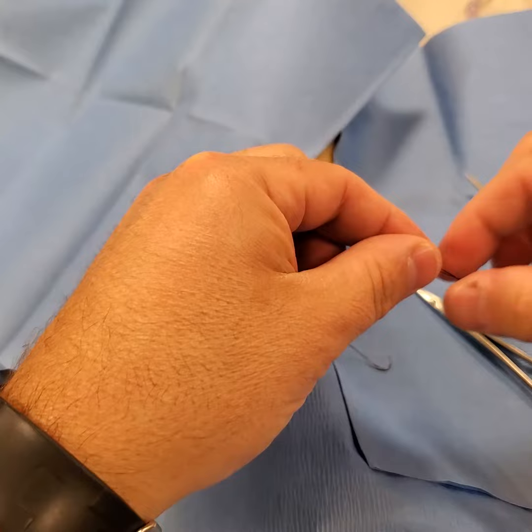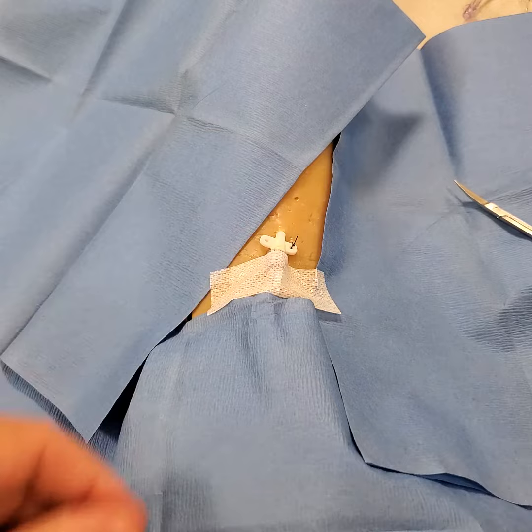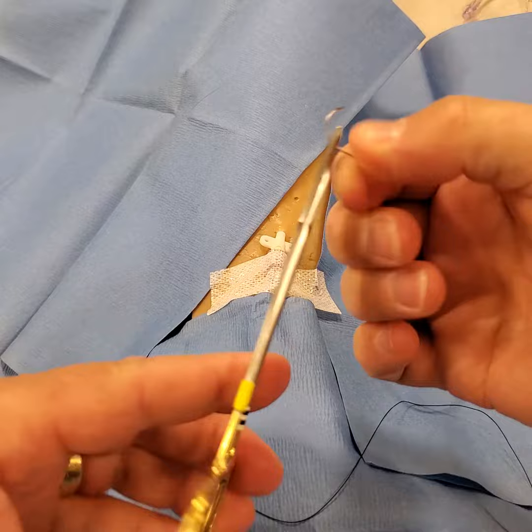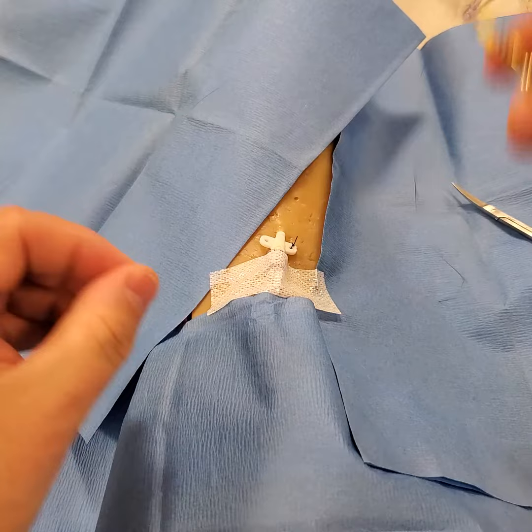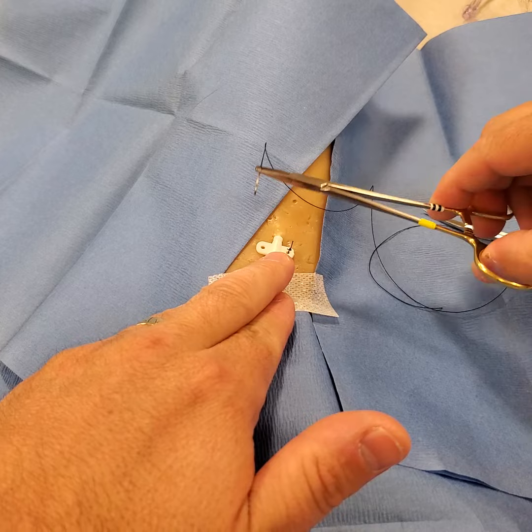Cut. Now, the other side. Most people being right-handed — if you're left-handed, if your left hand is dominant, you could start on the left side and go that side first. With being right-handed, most people will try to start and initiate this side, but I find this increases your risk of getting a stick from the suture.